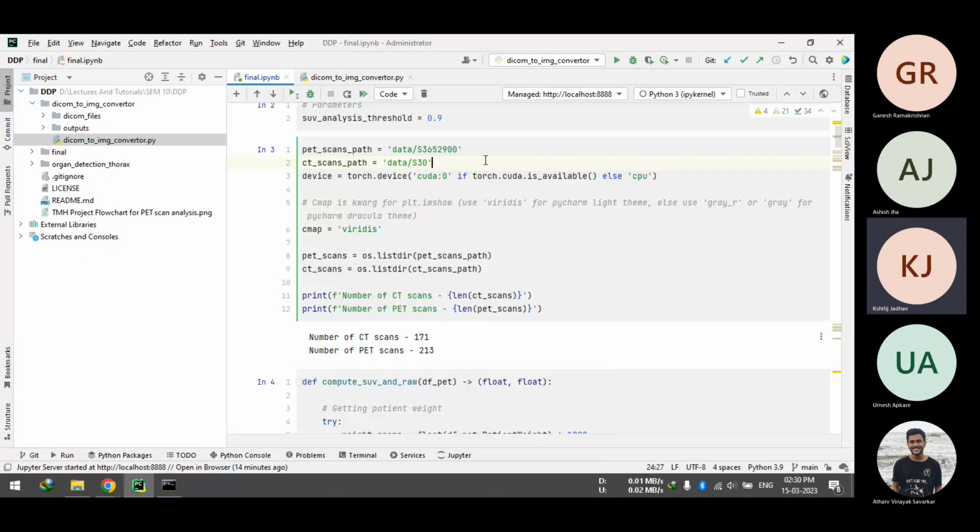What I'm saying is, with that hard coding approach, you are able to generate the organ contours. Suppose you have generated organ contours for 200 patients, then we may use those contours to train our model, right? Yes.